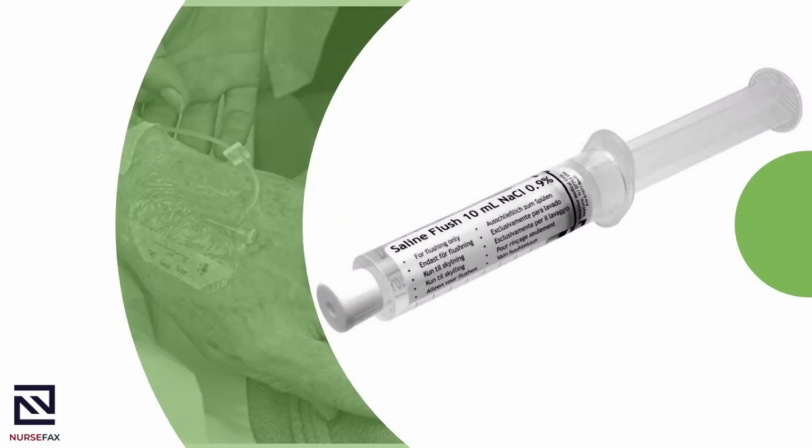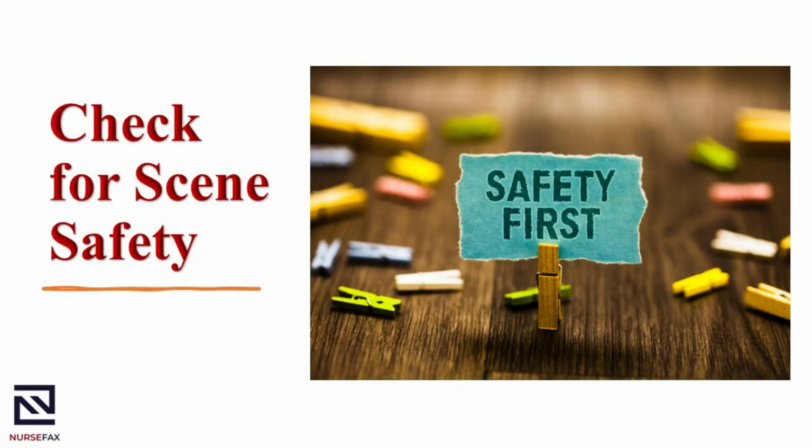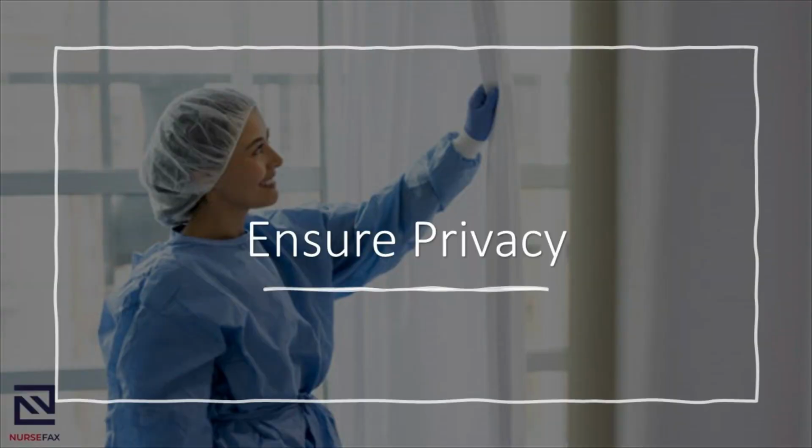Introduction phase. In the introduction phase of the intravenous flush and visual infusion phlebitis score assessment, you will need to perform all of the listed below. The mentioned below are almost the same for each skill station in OSCE, however, prioritize as needed. Checking for scene safety. Close the curtain or door to ensure privacy.